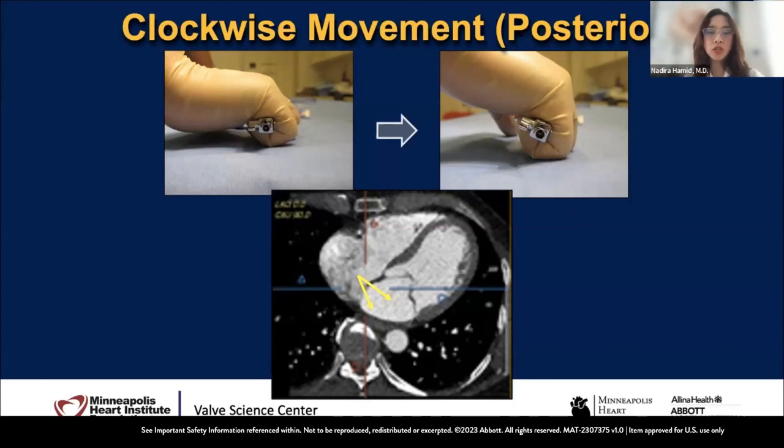Is the communication, I think you and I, both of us, the imager and the interventionist. If you make small movements, always check with us imagers: did I move? Where did I move? And if your imager can't find you, give her or him time to locate where you are, because some of the small subtle movements change the images. Am I right, Ryan? Absolutely.